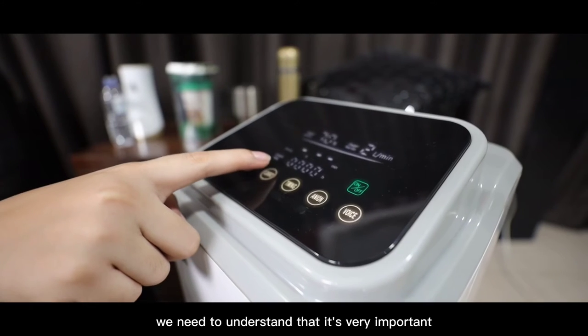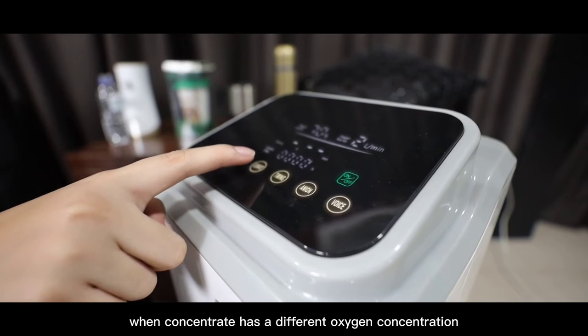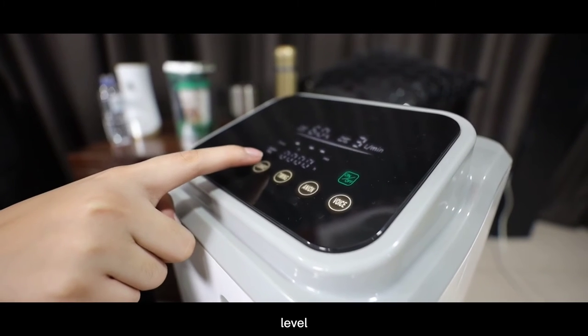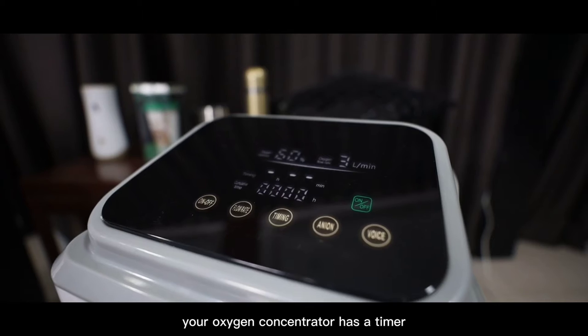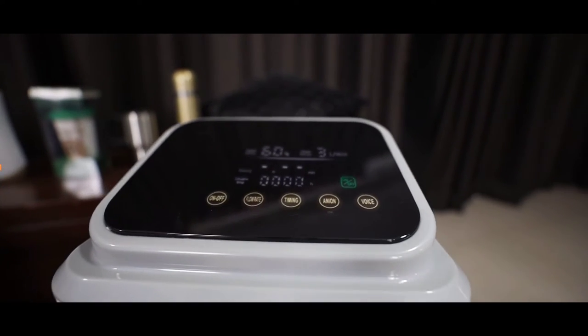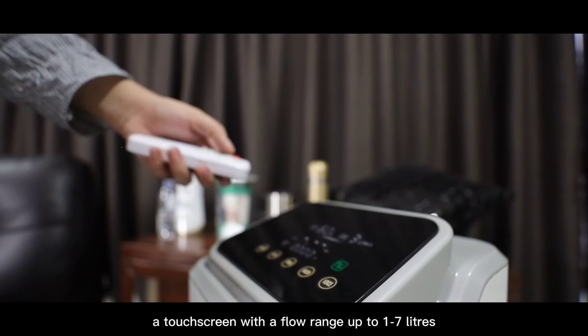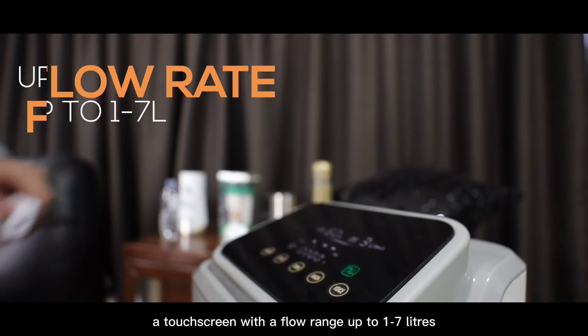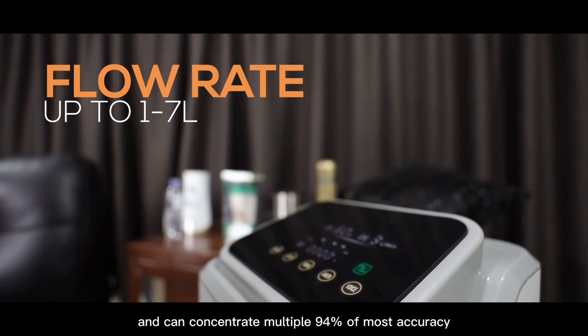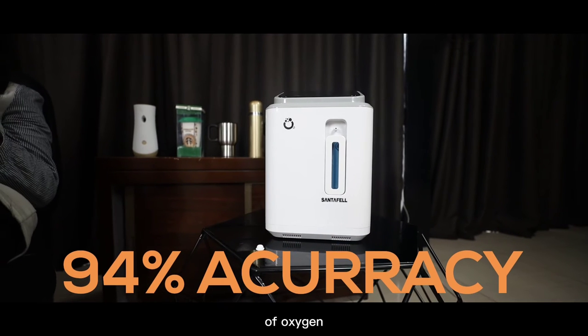It is very important to understand that each concentrator has a different oxygen concentration level. Your oxygen concentrator has a timer, a remote control, and a voice prompt, a touch screen with a flow range up to 1-7 liters, and can concentrate 94% accuracy of oxygen.